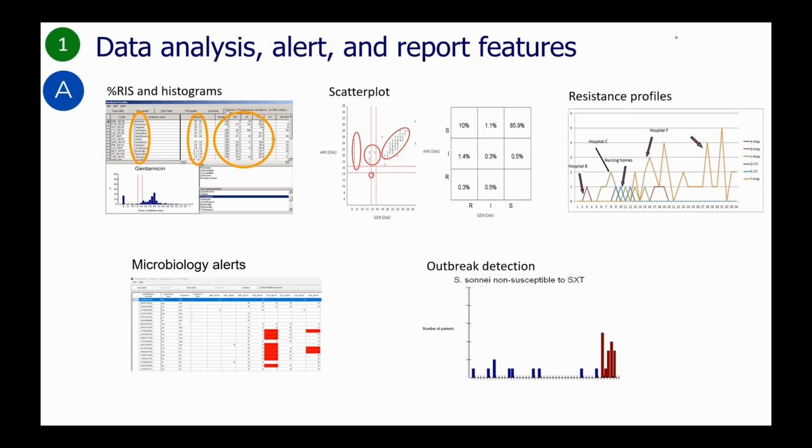The next figure is a scatter plot, comparing the result of two antibiotics, in this example, gentamicin and amikacin for Klebsiella pneumoniae. This kind of presentation is valuable for the pharmacy in examining issues of cross-resistance. This is helpful in determining recommendations for first-line therapy and second-line therapy.